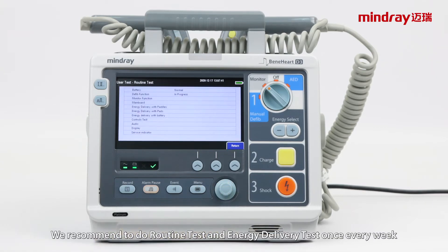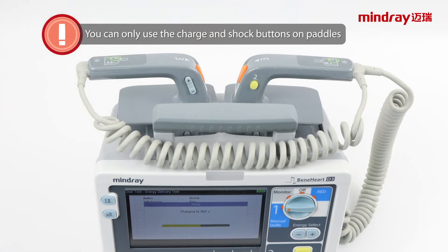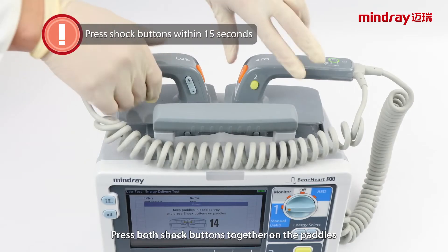We recommend doing the routine test and energy delivery test once every week, and controls test once every year. Press the charge button on the paddles to charge.